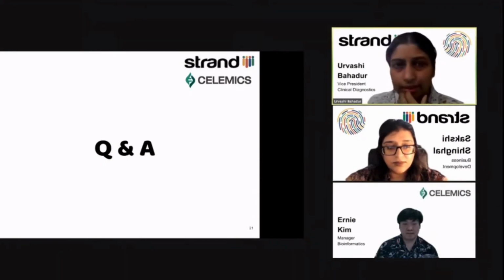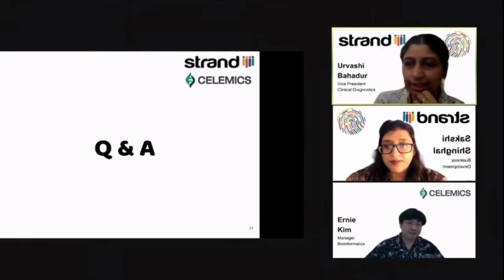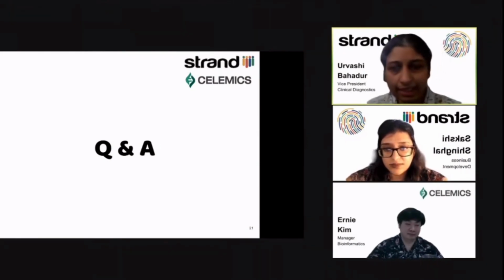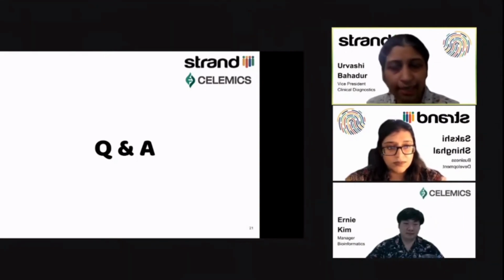Right. So I can explain what we do, and then I don't know if Ernie wants to answer something as well. It depends on the secondary pipeline, of course. But after that, we can take a look. Typically, what we've seen is that if there are some variants which come very frequently, these kind of systematic errors are panel artifacts.